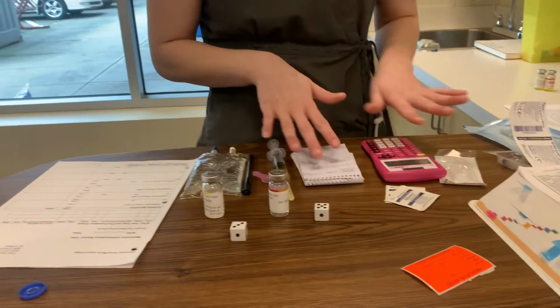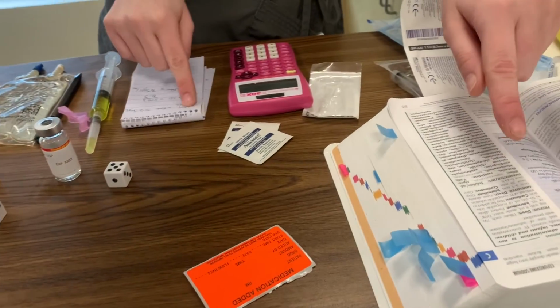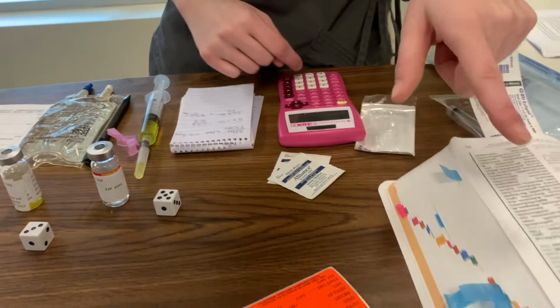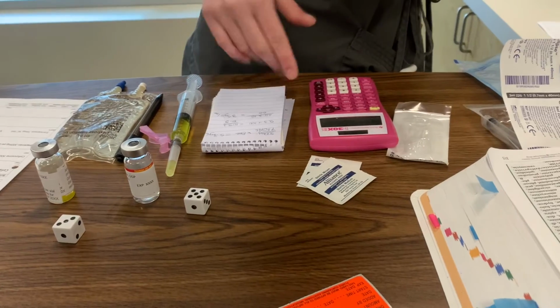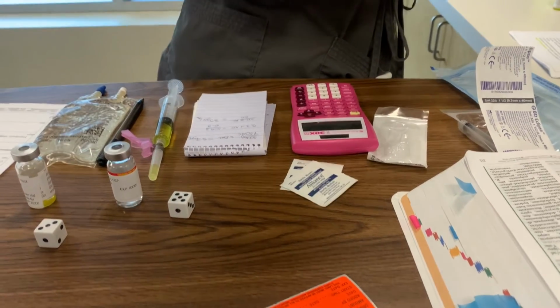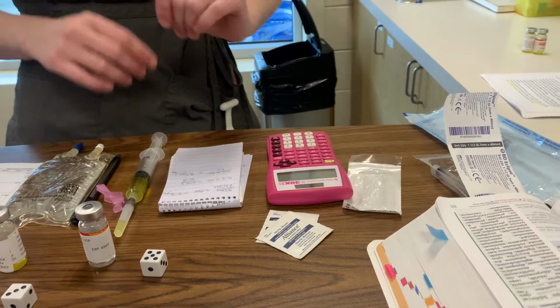I'm just going to double check all of my calculations here. So 500 was my dose ordered, 750 is my dose on hand, times that 8 milliliters we injected, perfect. I added my 100 milliliter mini bag to get 35 drops per minute. I have my 5.3 here, just double checking that, wonderful.